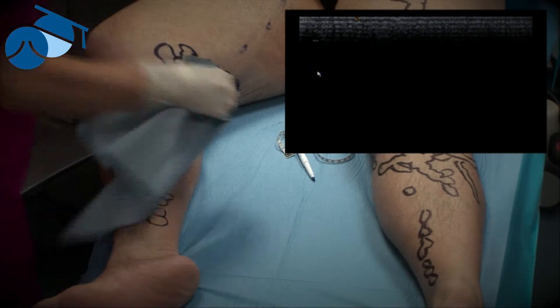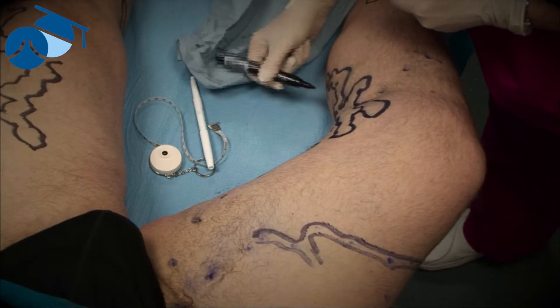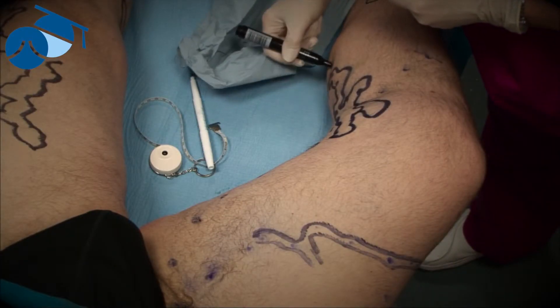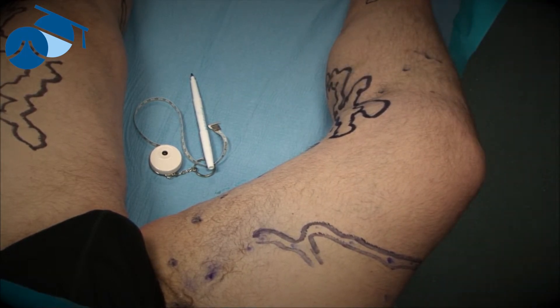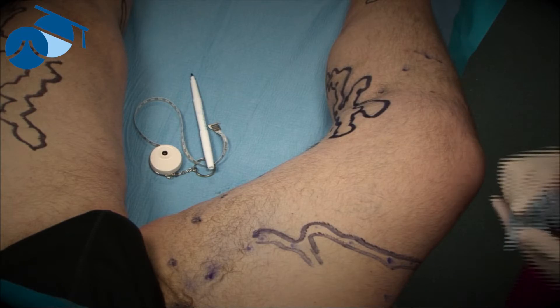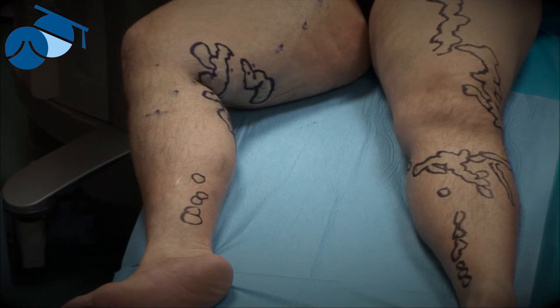Now we're going to treat this using the TRLOP closure technique, which is a Transluminal Occlusion of Perforator. We mark where the perforator is so we can come back when sterile, use local anesthetic at the time to numb the area, get into the area cannulated, and then close it with whichever device we're going to perform TRLOP with.